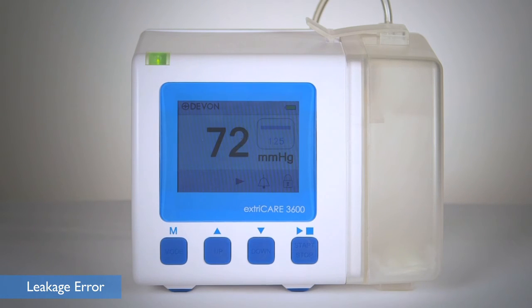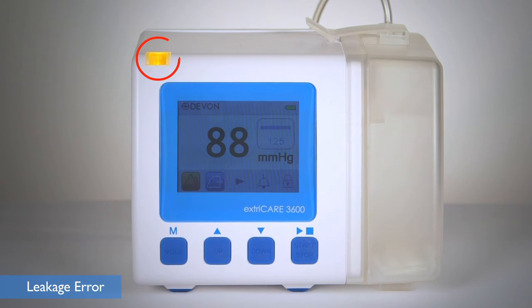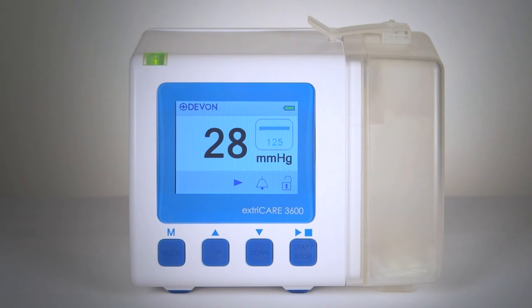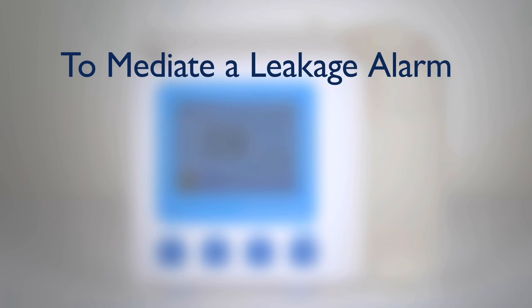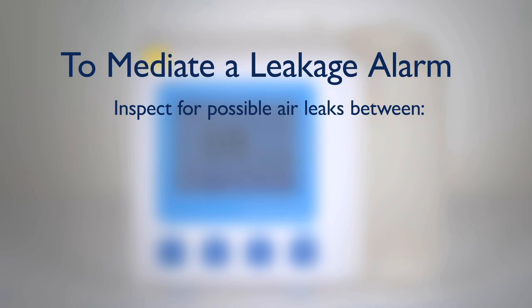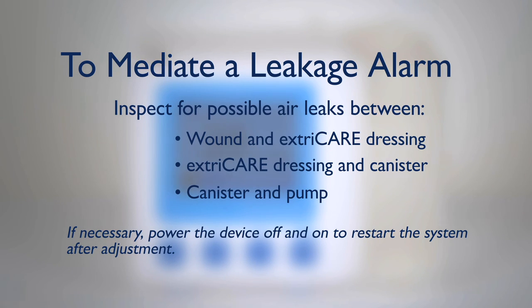The leakage error alarm will sound if the pump is unable to reach 80% of the preset pressure after 5 minutes. The yellow LED will stay on constantly and the minor leakage error symbol will appear on screen; the pump will stay on. If the pump is unable to reach 50% of the preset pressure after 2 minutes of effort, the alarm will sound, the yellow LED will flash, and the major leakage error symbol will appear on screen. The pump will remain on but will power off after 10 minutes of continuous alarm. To mediate a leakage alarm, inspect for possible air leaks between the wound and the ExtraCare dressing, the ExtraCare dressing and canister, and the canister and pump. If necessary, power the device off and on to restart the system after adjustment.